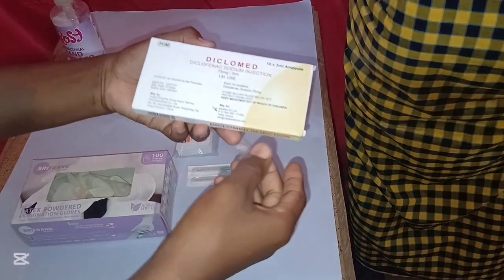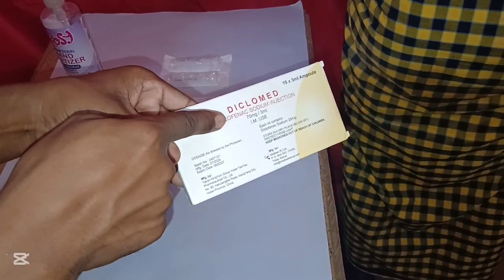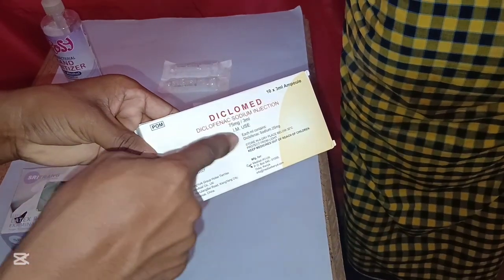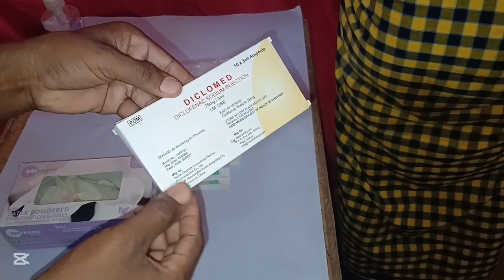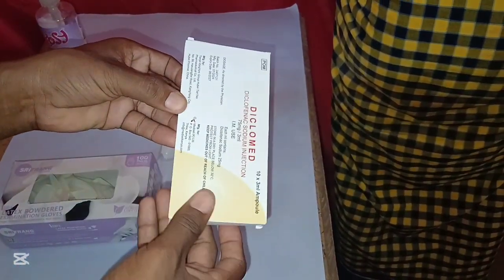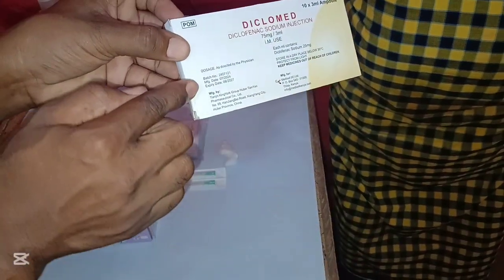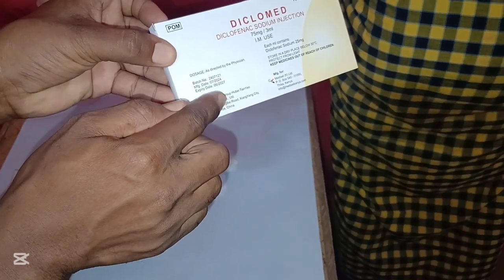Then you get the drug. Make sure you check the name of the drug — that is Diclofenac Sodium injection 75 milligrams per 3 ml, for IM use only. You are supposed to give the drug for intramuscular injection only. Also make sure you check the expiry date of the drug, which is 06 June 2027.